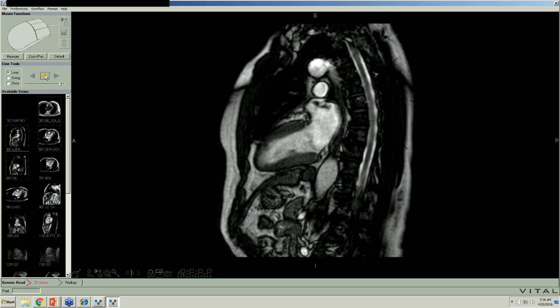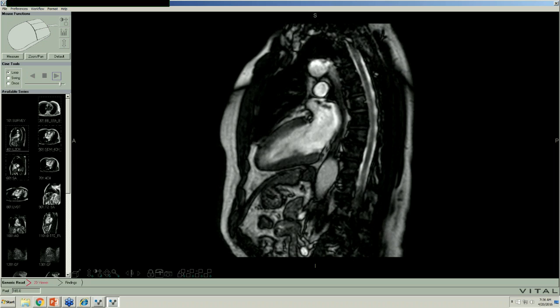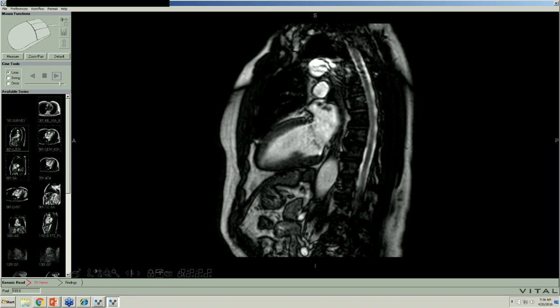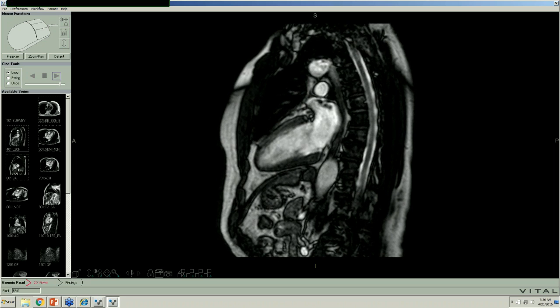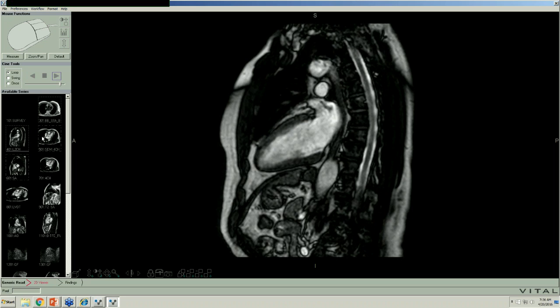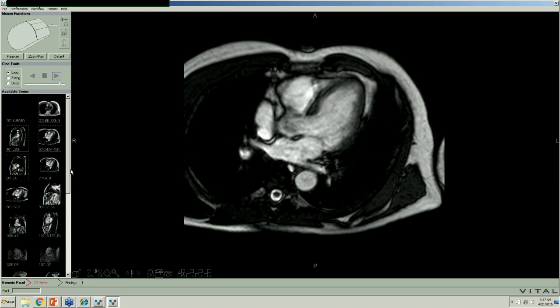And this is a non-contrast study. Look how pretty. It's almost like you got contrast. Looks like contrast. Looks like a coronary. Looks like a left ventriculogram with angiography. And so you see the mitral valve looks very competent. Left ventricle looks very competent. Nice contractility, symmetrically. No enlargement in any chambers. And we can just flip them over, I'll show you these images.